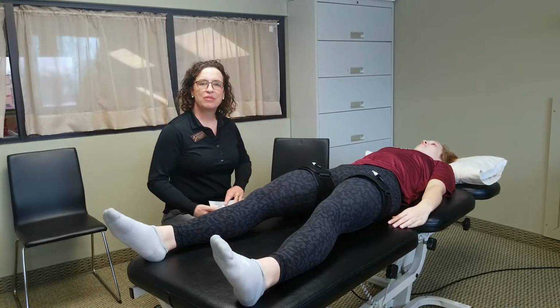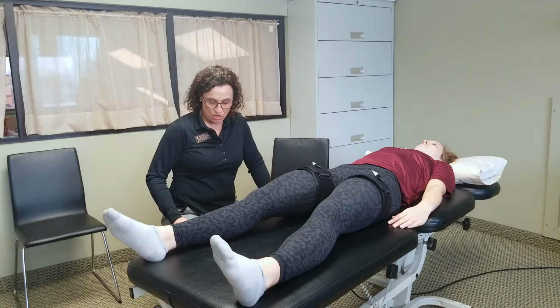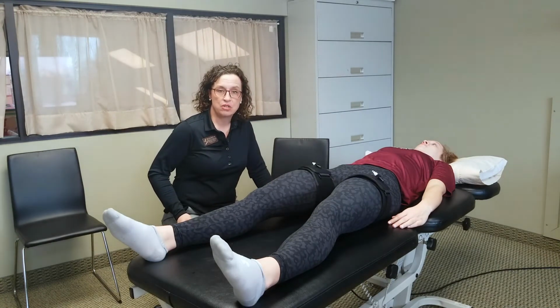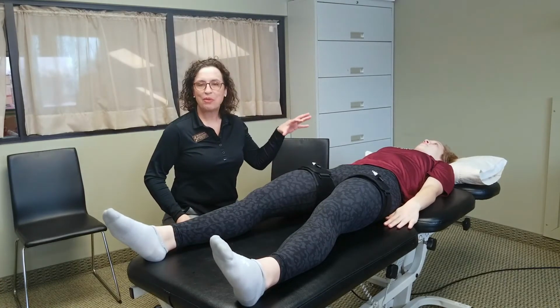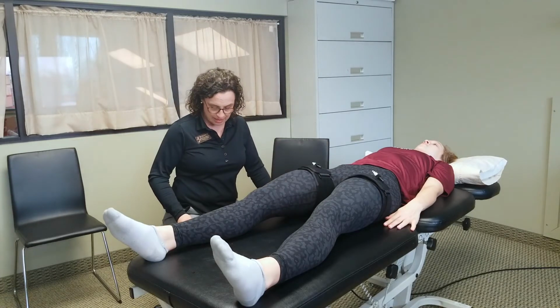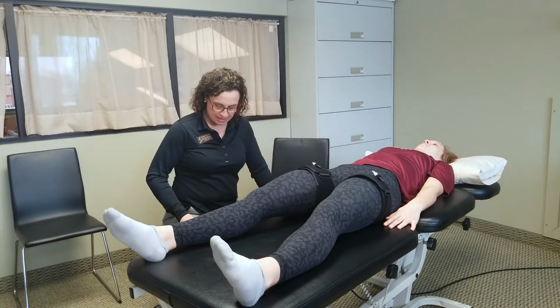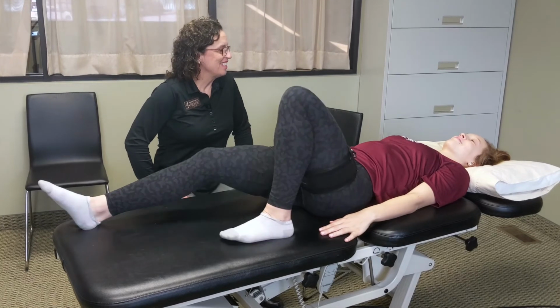We know based on the research now that's come out about blood flow restriction therapy that you can have tendon remodeling that improves and is sped up by using this with exercise. You can have bone remodeling that you can possibly improve the speed with which a stress reaction or stress fracture or other fracture would heal. That the body, through the chemical soup and hormone influences with blood flow restriction therapy, actually produces capillary angiogenesis. It develops more blood supply in the legs or the arms. You have more collagen, you have decreased scar formation, and lastly, increased muscle protein. And that's what all the research is showing. Now, Rachel, you got 15 more, and you'll be done.